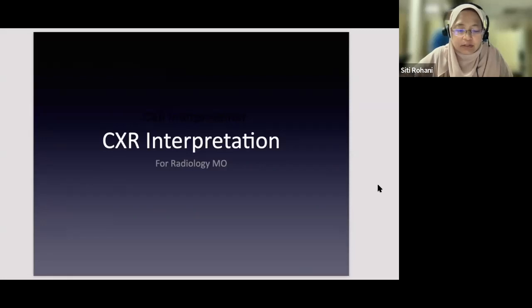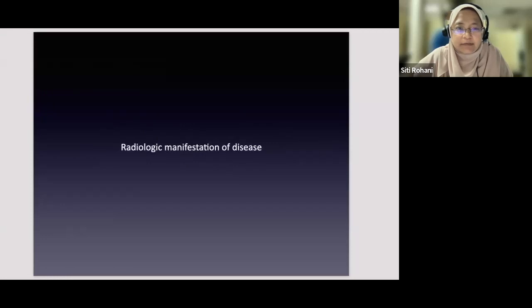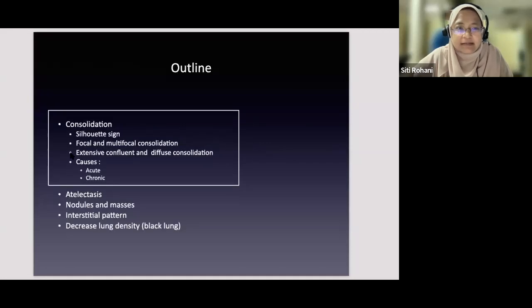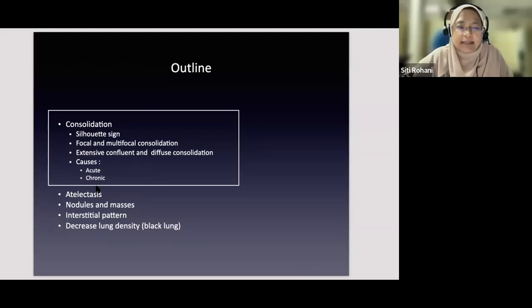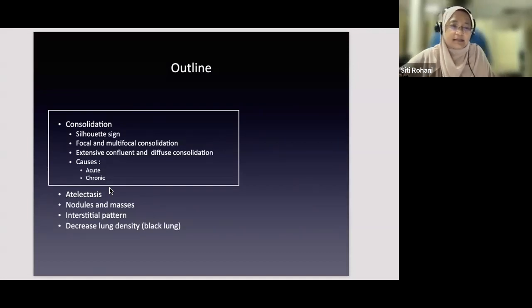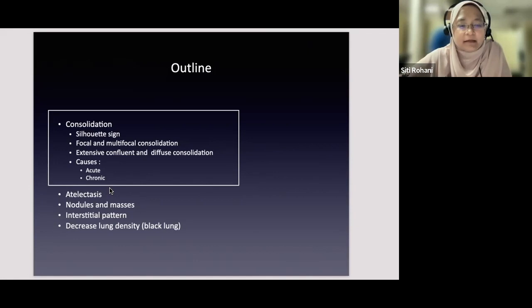The lecture today will be in two parts. The first part I will be talking about radiologic manifestation of disease, basically focusing on consolidation and atelectasis. After that, I will be talking about example chest X-ray cases in the emergency setting. I think this is the second or third time I have given this CME lecture to ED, so it is a little bit different from the previous lectures.